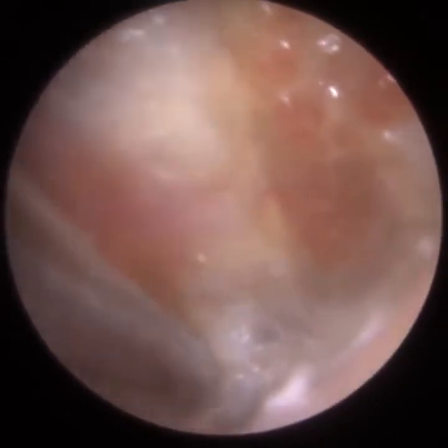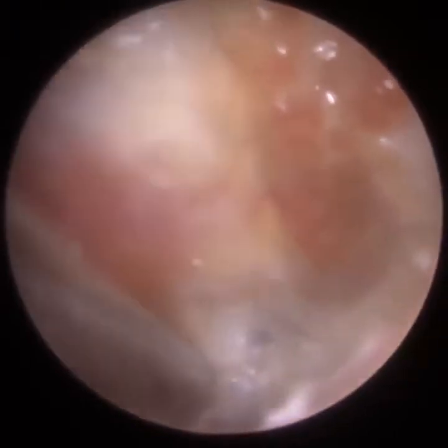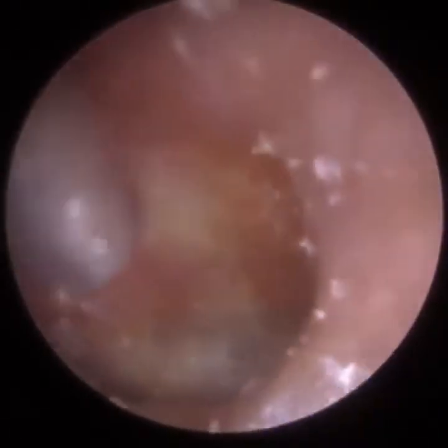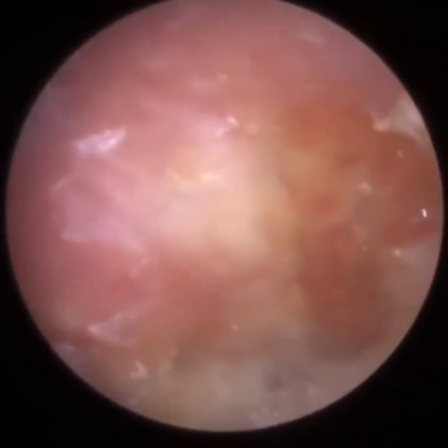Yeah, there's a bit of dampness there on the eardrum. So the patient is aware they've got to be really, really careful to avoid water entering the ear. So I think that's the procedure done.